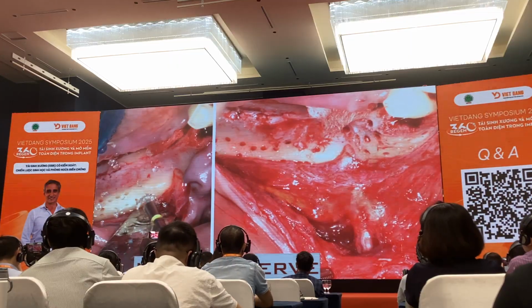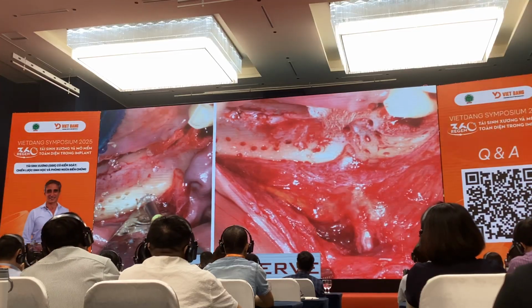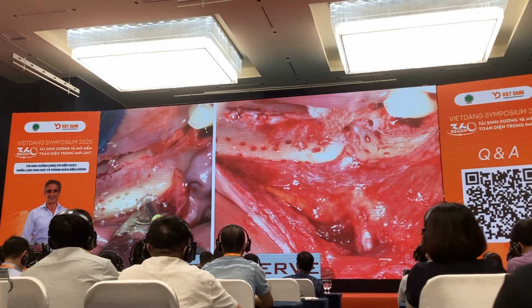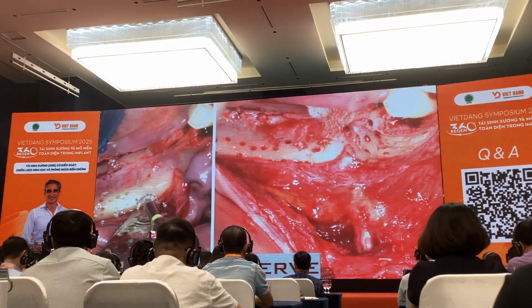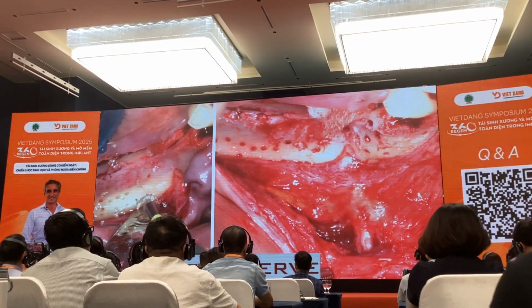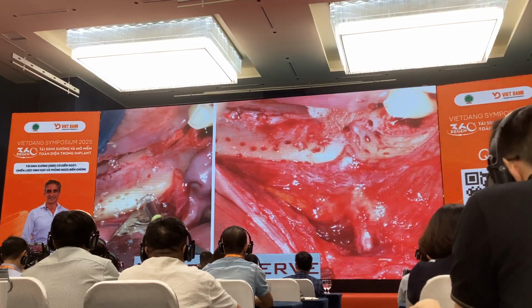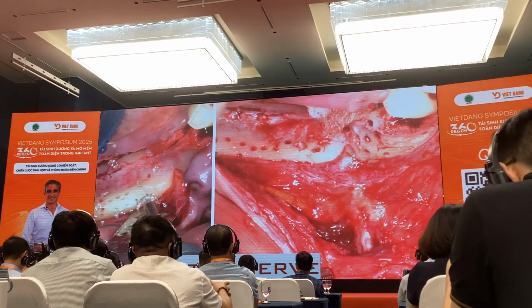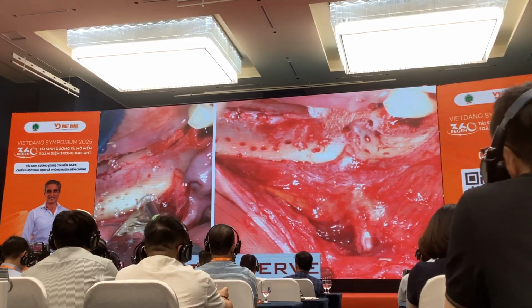The brushing technique, the technique that I published in 2015, is a very selective surgical procedure with which we can protect the integrity of the nerve without any risk of damaging it. By detaching the submucosa from the muscle, we can extend the coronal displacement of the buccal flap for 3-4 centimeters, respecting the integrity of the nerve.